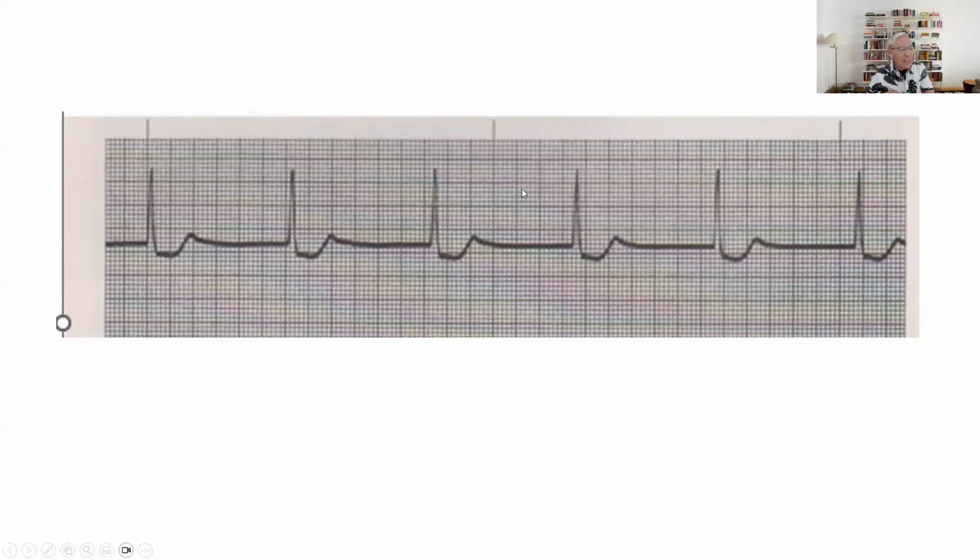Yeah, because this last one right here, you're not going to count it. Why? It's already outside of the line. You're only going to measure the 6 seconds. So always, if that last line is outside of that line, do not count it, before and after.